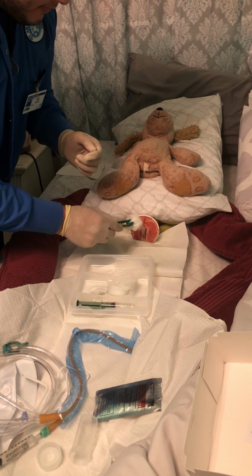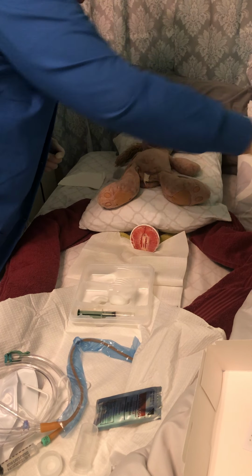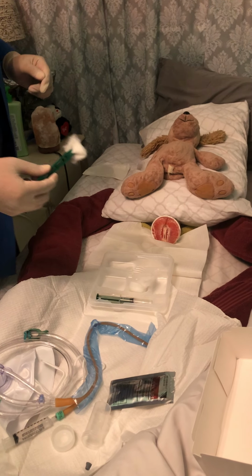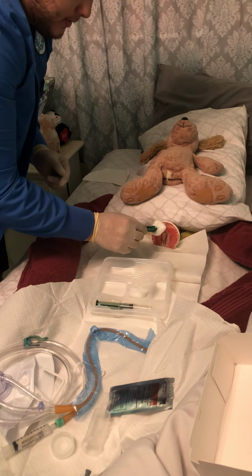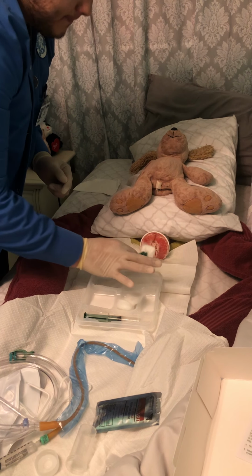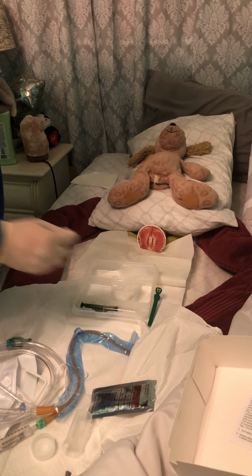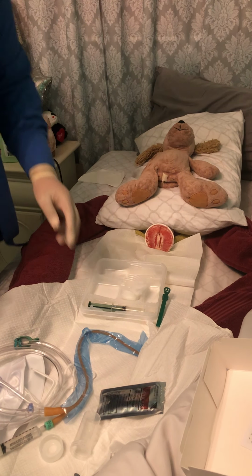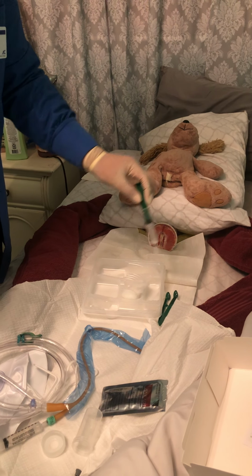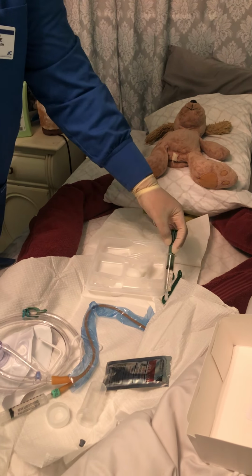Alright. And then we're going to go ahead and wipe down this way. Get rid of that cotton ball. Alright. And then the final cotton ball, you want to just go straight down the meatus. Get rid of that. Alright. So once we've cleaned the patient, you would take this syringe here. Then you would squirt it out in a certain area of the tray, any area you want.